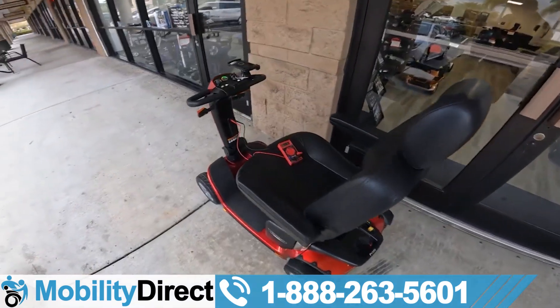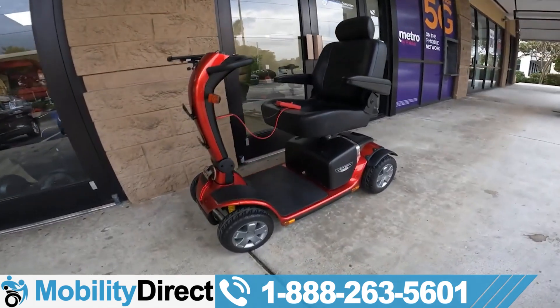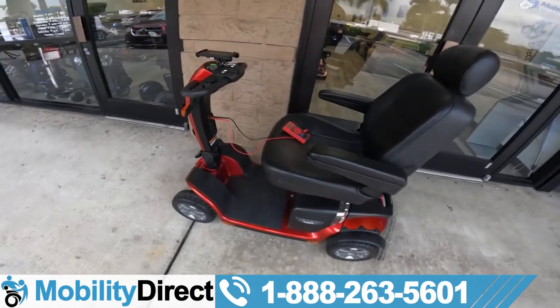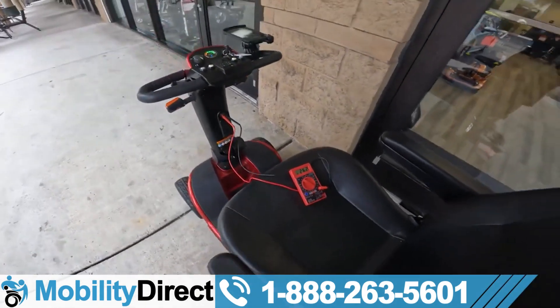Hey everyone, it's Richard with Mobility Direct. We got this Victory Sport outside our shop. A customer wants us to test the batteries and see if they need to be replaced. I'm going to give you a quick and easy way that you can do this at home.